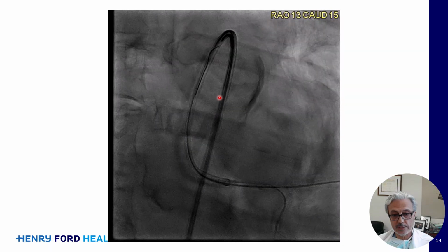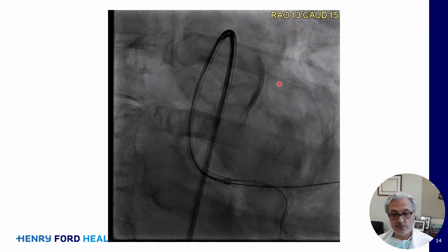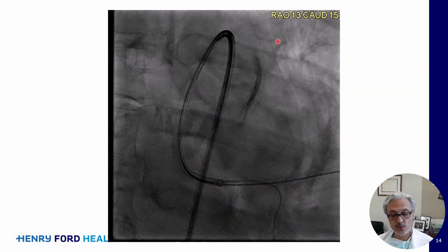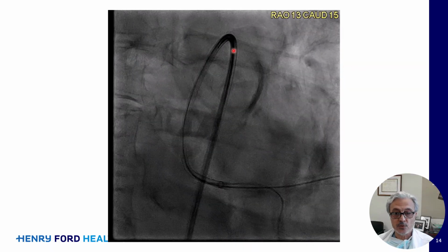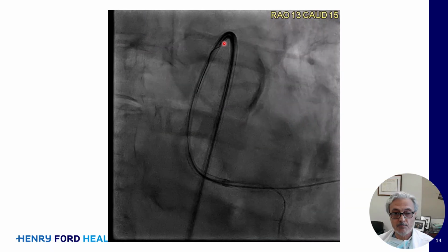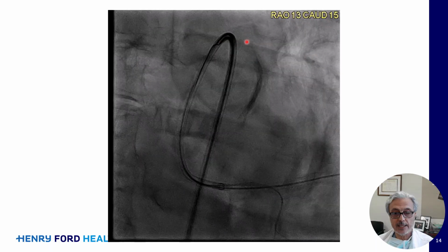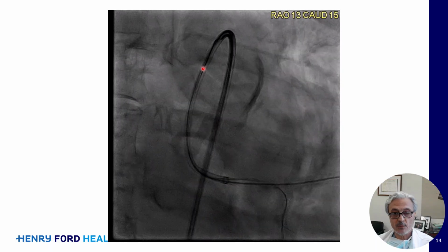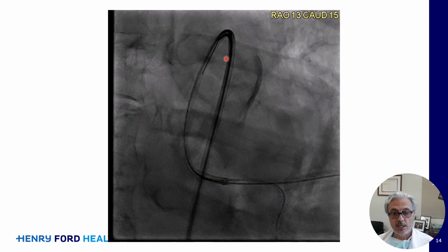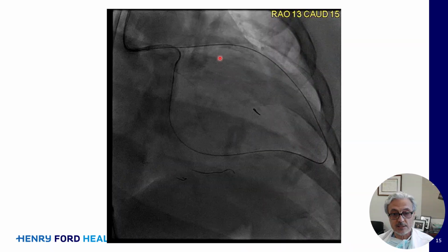After we wired the guide catheter, now the Fielder FC is an excellent wire to do tip injection. So when you do tip-in, you basically put the microcatheter antegradely in the guide in a curve, and you come back with the wire, and I literally wired the microcatheter with the Fielder FC. So at this stage, you advance the microcatheter.